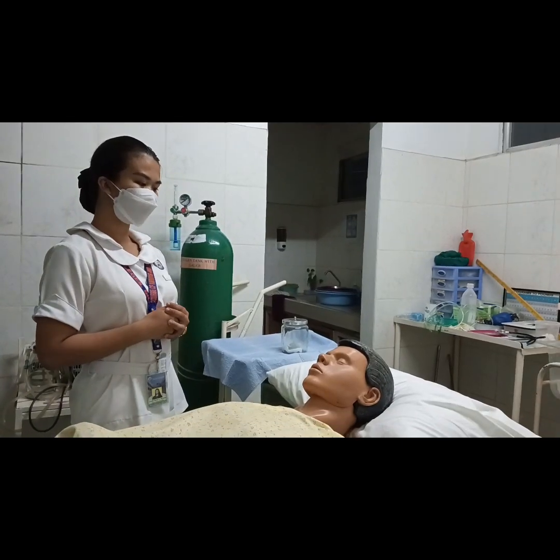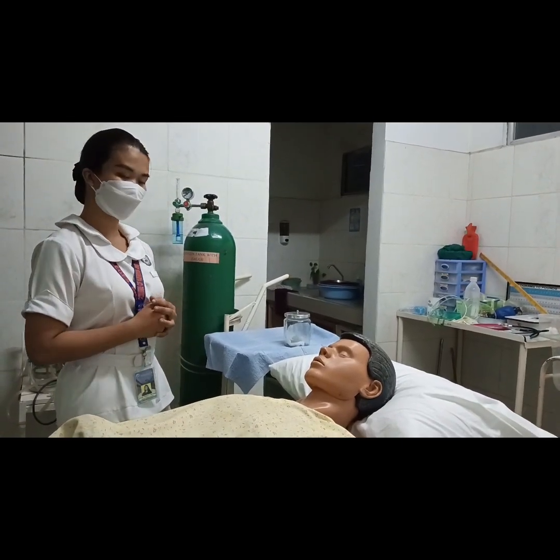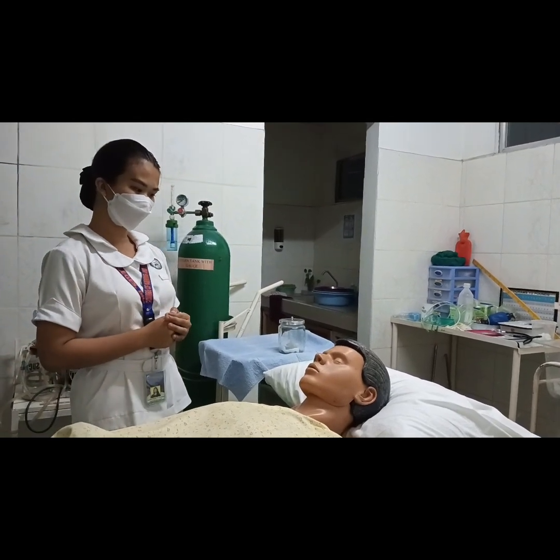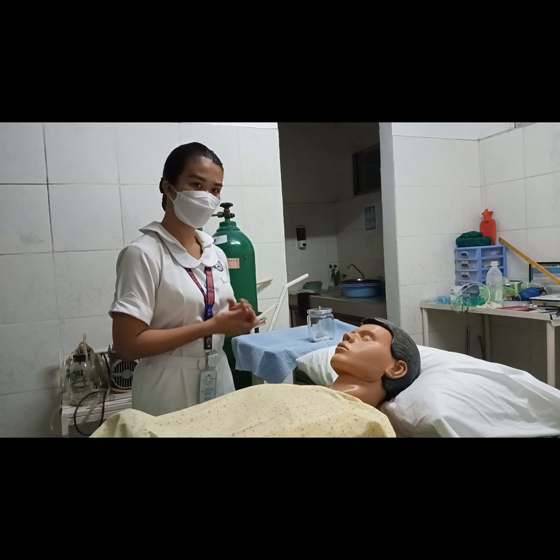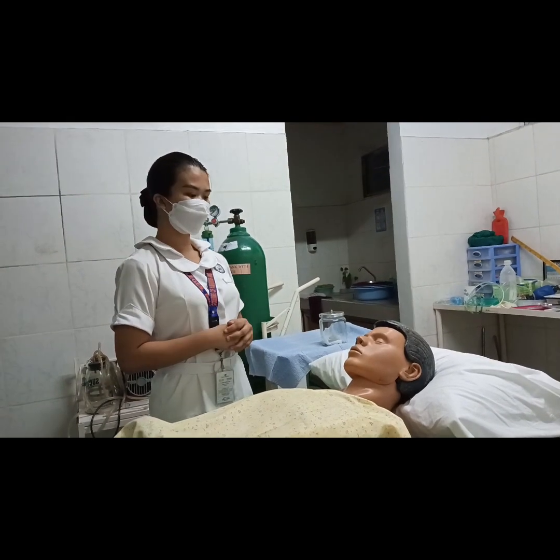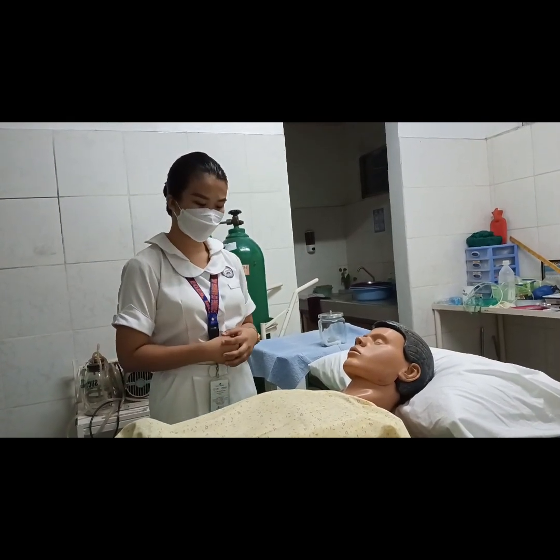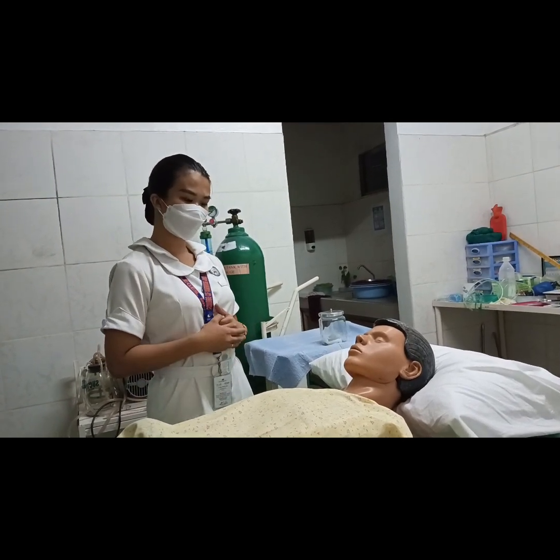Next, I will evaluate the client's immediate response to the oxygen administration and his comfort with oxygen use. I will then assess again the client's vital signs — pulse rate, respiration rate, and blood pressure.